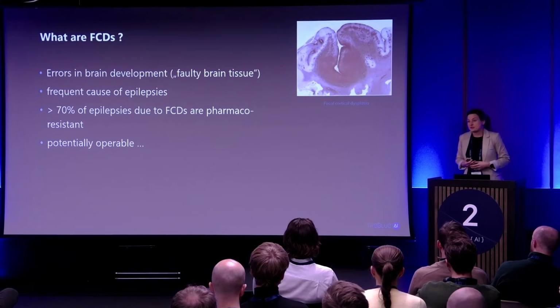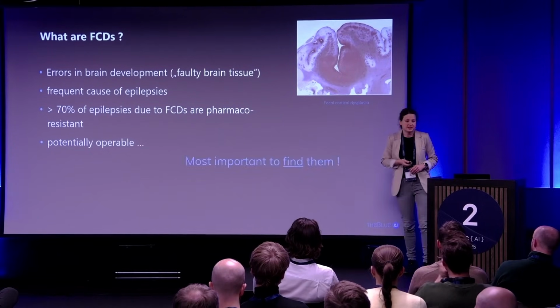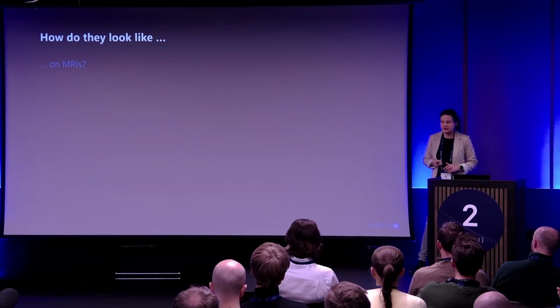The good news here is that the FCDs are potentially operable, but the most important thing here is to find them. So how do they look on MRIs?